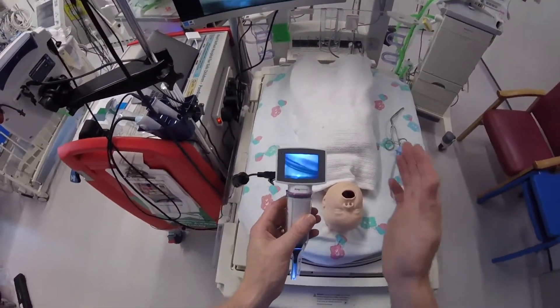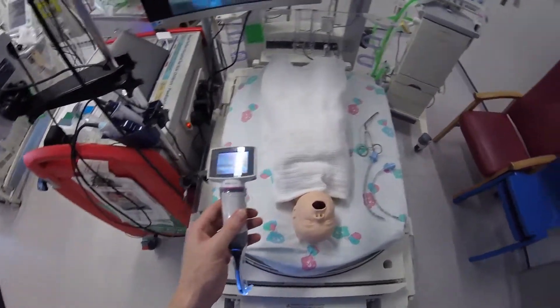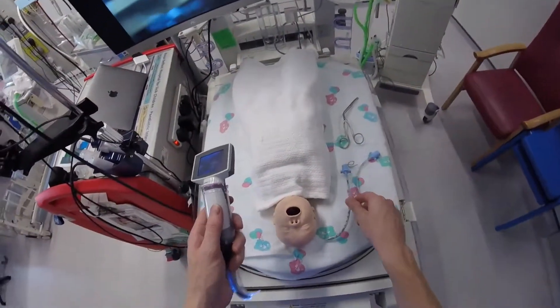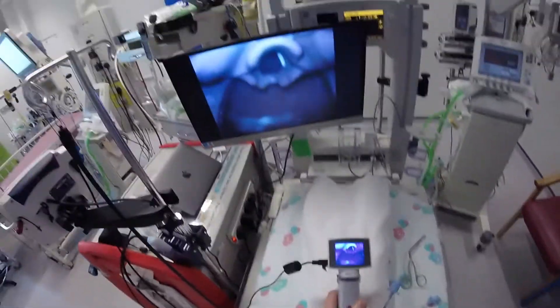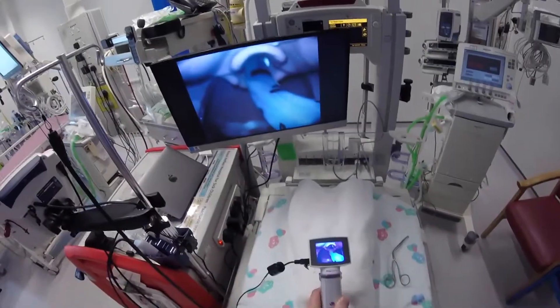We've got the KeenVision loaded up with a size 1 Paediatric A-blade. It's really straightforward to use. We've got a styletted endotracheal tube — we just drop this into the mouth, put the tip in the vallecula, and drop the styletted tube in through the cords. And I've got lovely control over this.